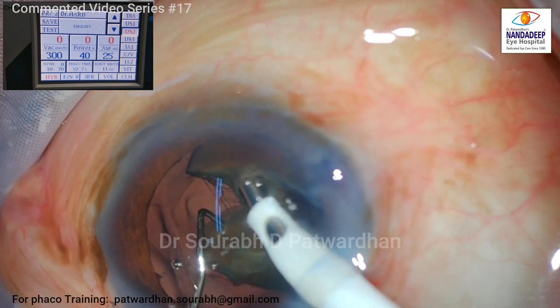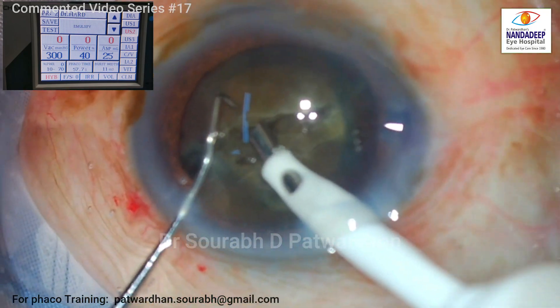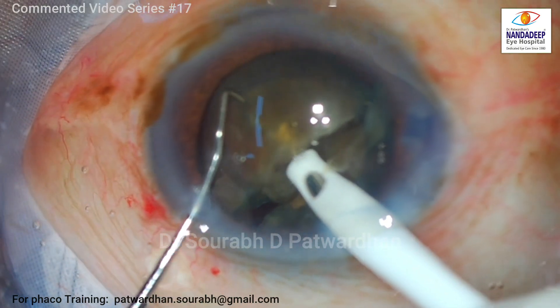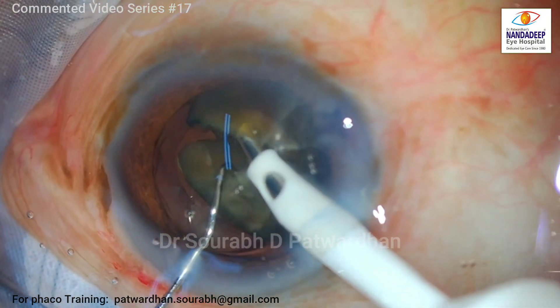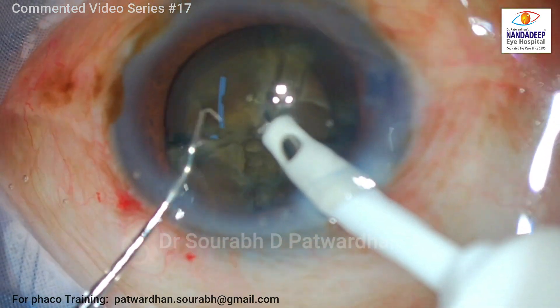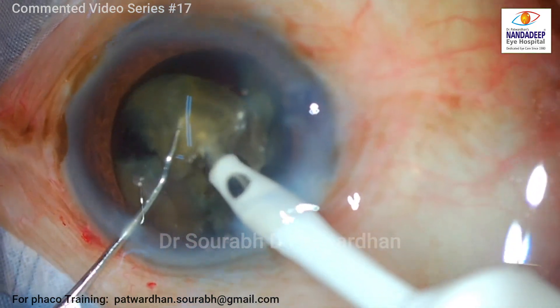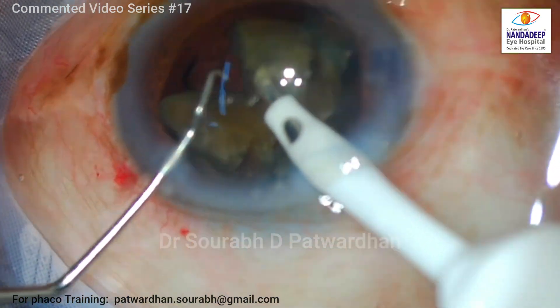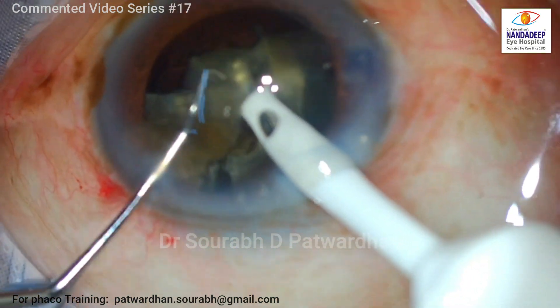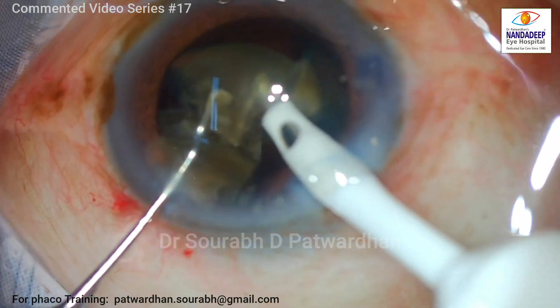With these parameters I get a good hold, and look at that hybrid chopper — it just splits the nucleus into two parts. The advantage of this hybrid chopper is the right kind of ergonomics: it can go around the nucleus and around the equator, and can do both horizontal and vertical chops. I have split the nucleus right through to the posterior plate, which is very important in these cases — the division should be as complete as possible. I am controlling the phaco with my foot switch: whenever the tip is buried I pause the phaco so I don't cut through and catch the posterior capsule. That experience is needed for such Morgagnian cataract cases.